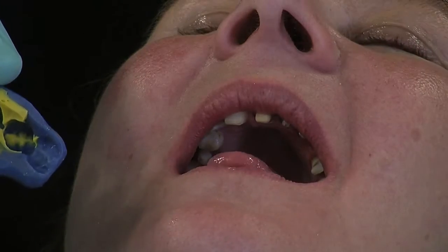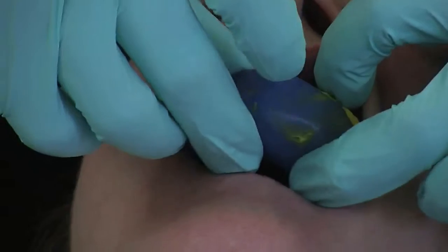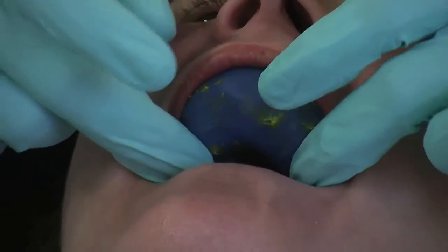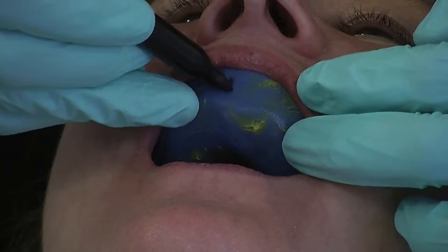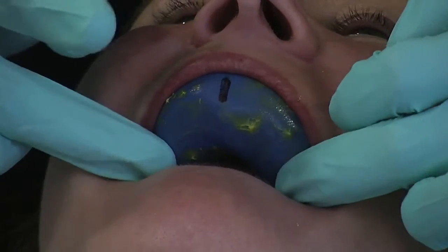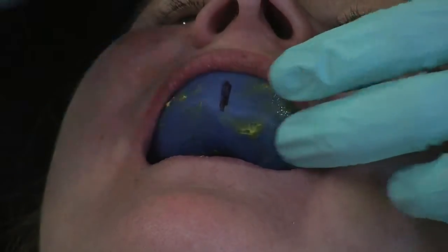So I'd like to try the index in the mouth now. I'm just going to bring that round here. This is from the wax-ups. That sits in nice and snug. Another great little tip is to mark the midline of the face onto the index, so that when I'm seating it properly live from behind the patient, I'll know exactly where to place it or the angle it's in.